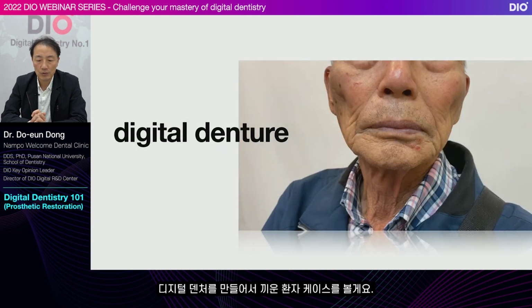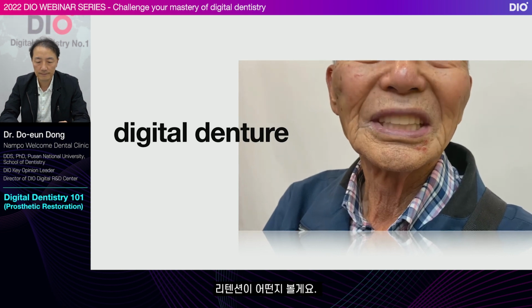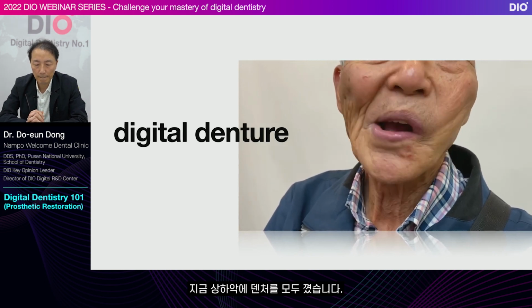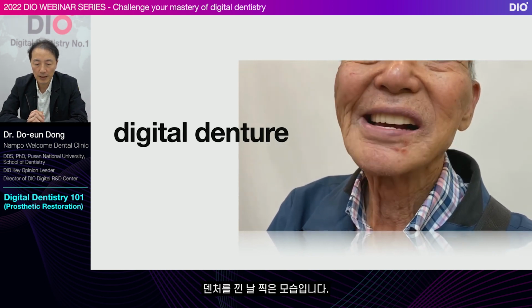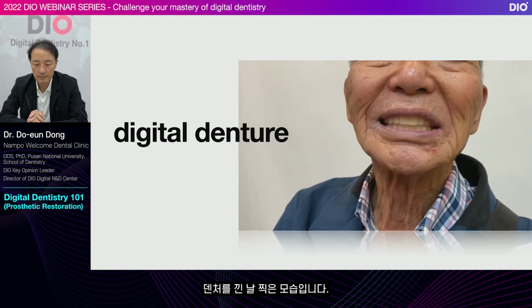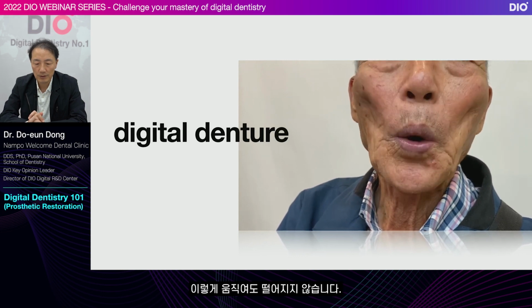Let's look at a patient case who got digital dentures. Let's look at the retention. This patient is wearing dentures for both the maxilla and mandible. This is the day the dentures went in. It doesn't come off, even with this much movement. So even the patient was surprised.